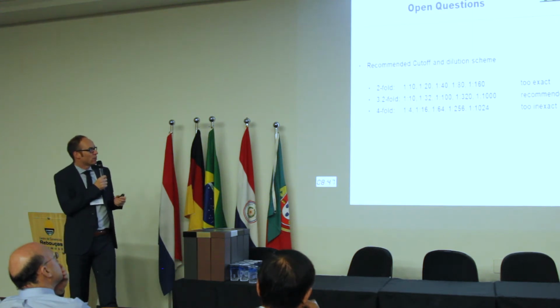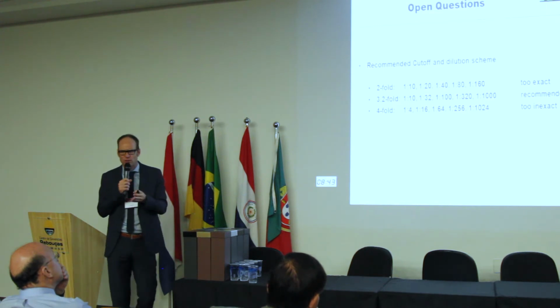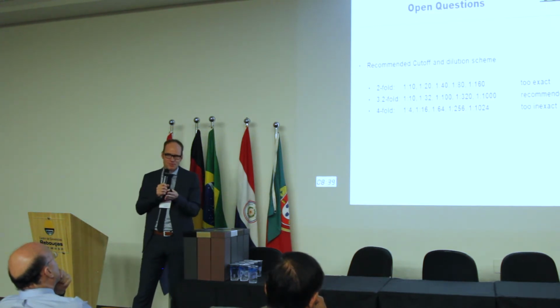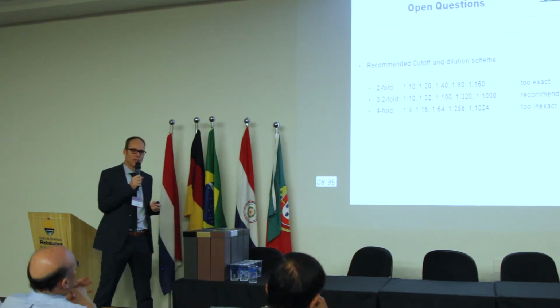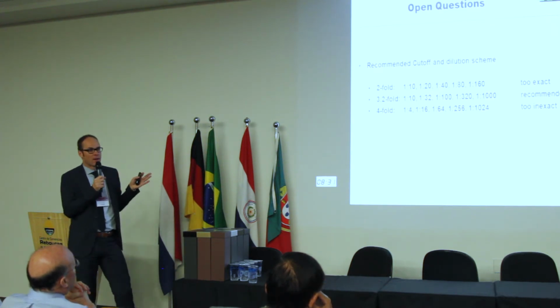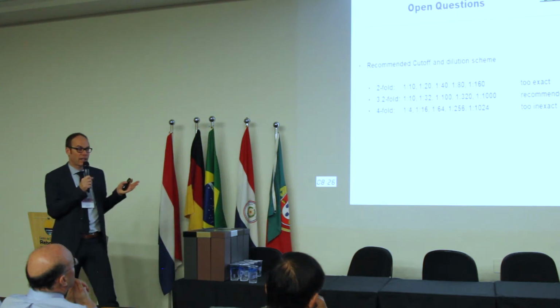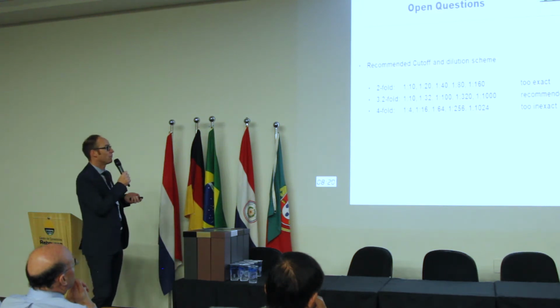One open question is also the recommended cutoff. So when I got it right, the Brazilian consensus recommends 320. Is it true? 320. Yeah. So ICAP recommends 1 in 160. The US still goes with 1 in 40. Japan still goes with 1 in 40. So it's still an open question what cutoff should be taken.